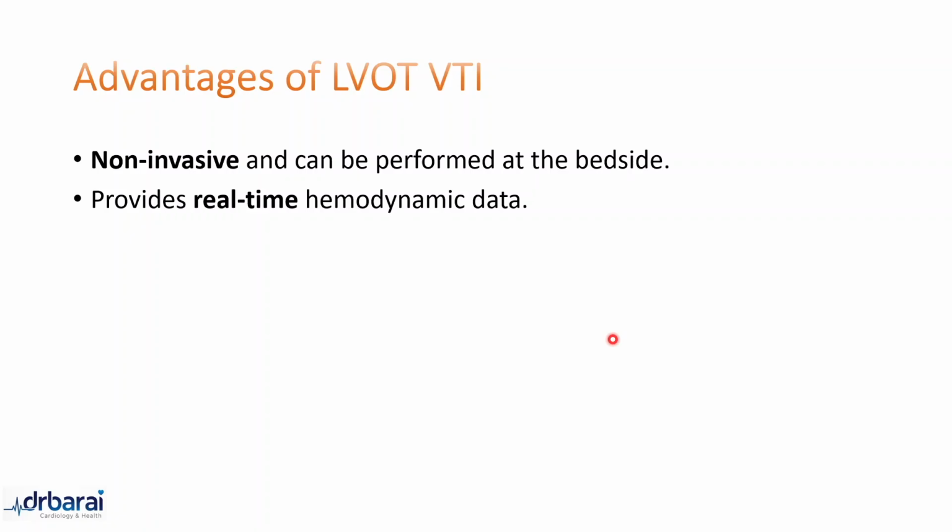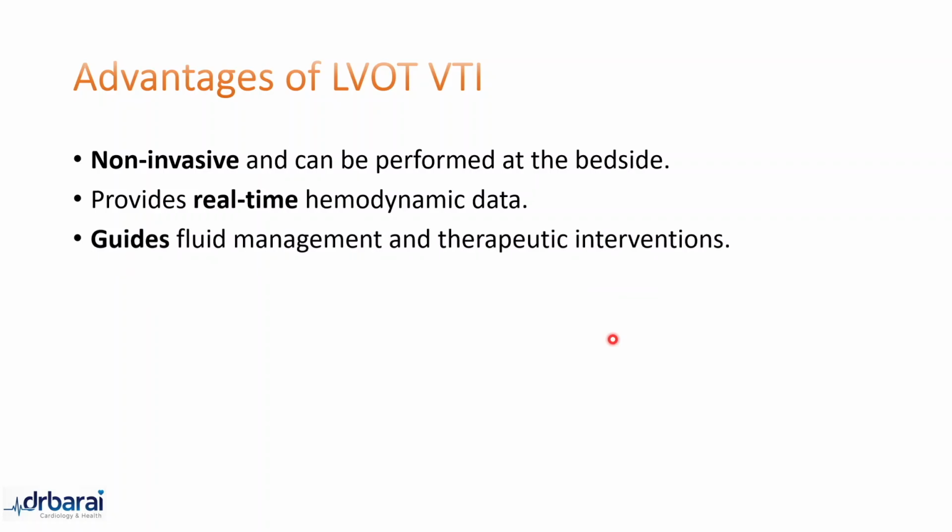So as we are talking to the patient, or to the nurse or the junior doctors, as we are giving them the instructions, we can actually find some LVOT VTI numbers, and that can guide us to the next step of the management, which is phenomenal.